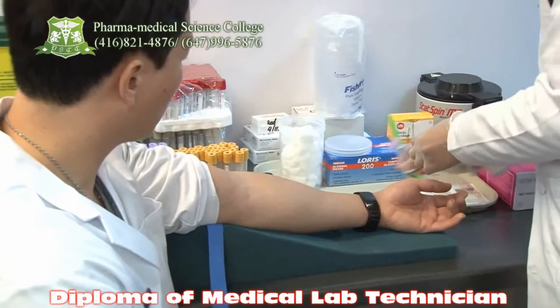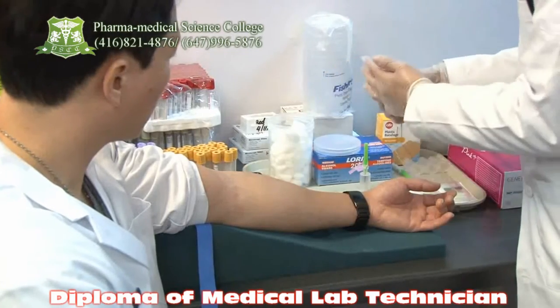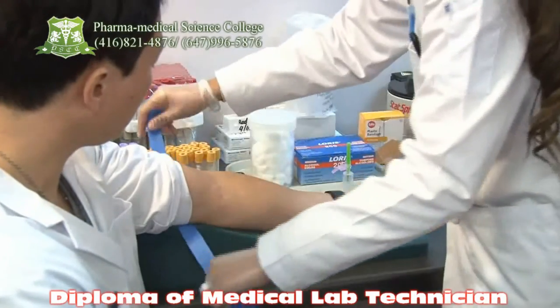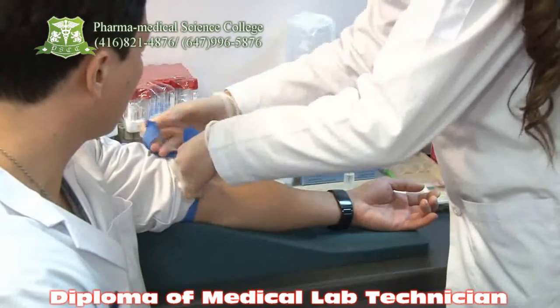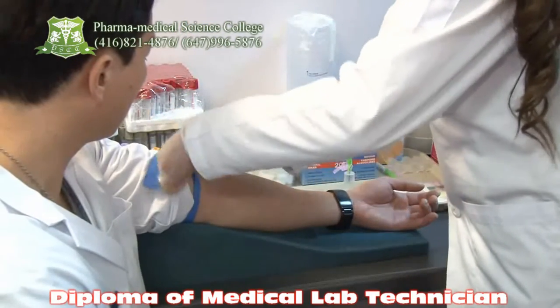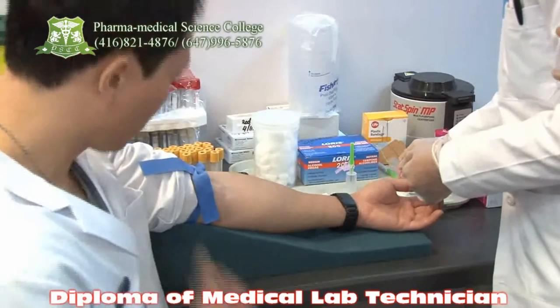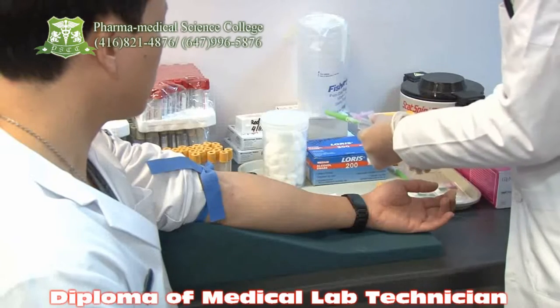Now she has to prepare her needle with the holder. Very good. Now take the cotton and put it between your pinky finger and the ring finger. Very good. Now take out the cover of the needle. Tie the tourniquet again. She is going to make the arrangement of the holder, needle, and the tube.